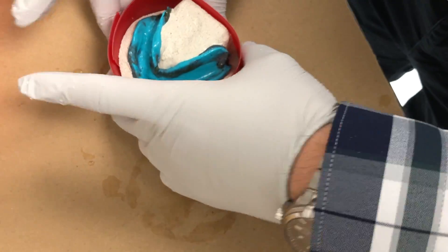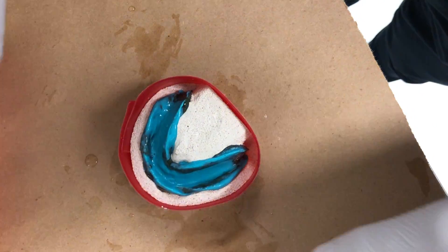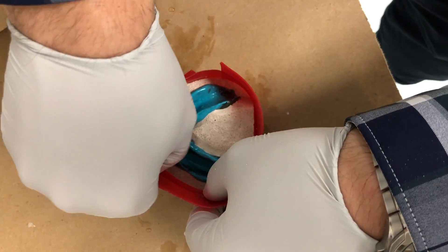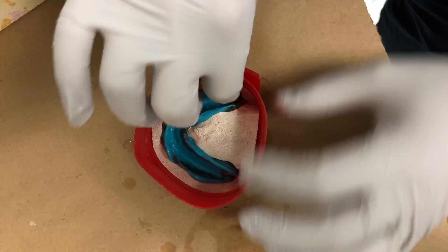Use boxing wax to box the plaster and pumice impression. Add wax accordingly so you have enough height for the poured stone. The poured stone should be about 1 inch high from the highest point of your boxed impression.